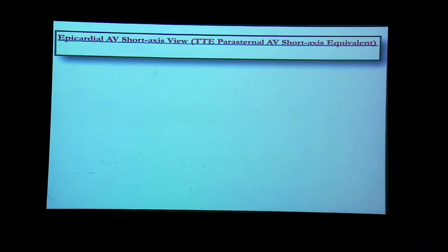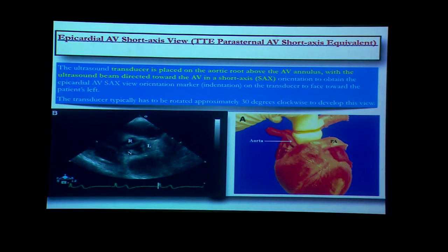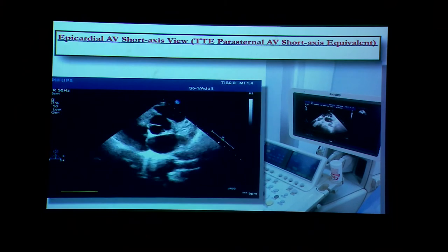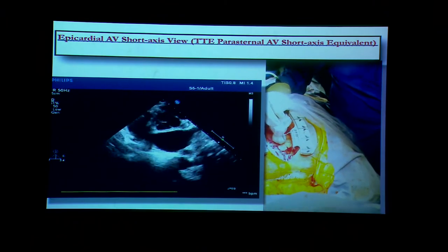Let us begin with the epicardial aortic valve short axis view. There are two aortic valve views: short axis and long axis. For the short axis, we place the probe on the anterior aspect — the aortic groove just above the annulus — with the ultrasound beam directed towards the aortic valve in short axis. This gives an image like the transthoracic parasternal short axis view, but with the right coronary cusp at the top. We place the probe just above the aortic annulus and perform clockwise rotation to obtain the Mercedes-Benz sign. At the top is the right coronary cusp, below is the non-coronary cusp, and on the right side of the screen is the left coronary cusp.